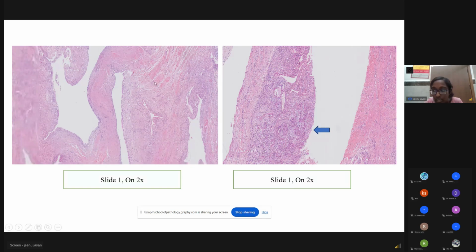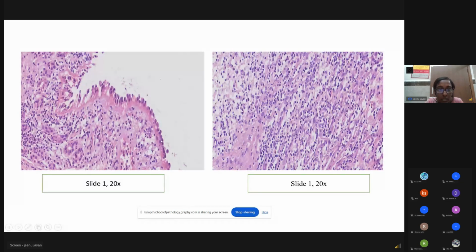It is showing many cystically dilated spaces lined by epithelium, and the subepithelium shows numerous inflammatory infiltrates along with muscle bundles. On further increase in power, the epithelium is lined by a layer of cuboidal epithelium, and at some places, hobnailing is also noted. The subepithelium shows many inflammatory infiltrates comprising lymphocytes, plasma cells, and eosinophils, and many proliferating capillary-sized blood vessels.